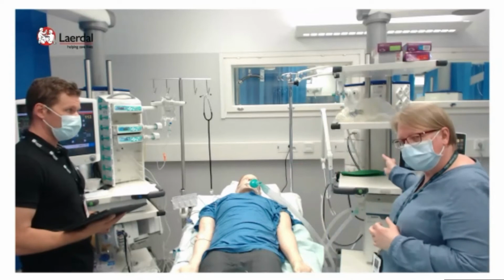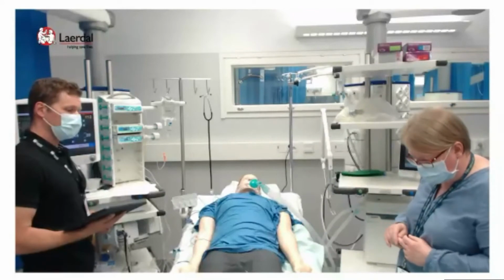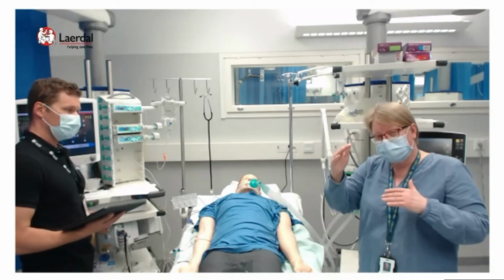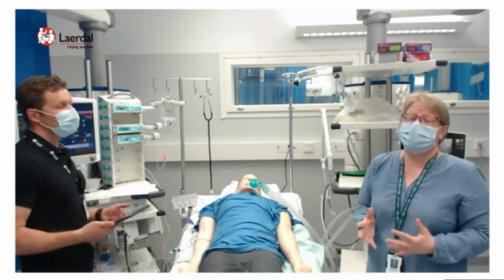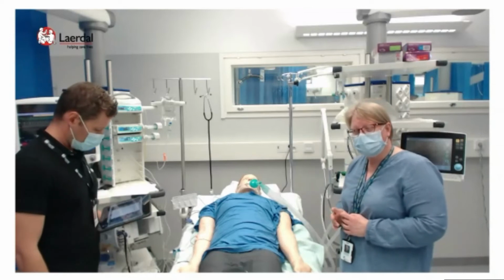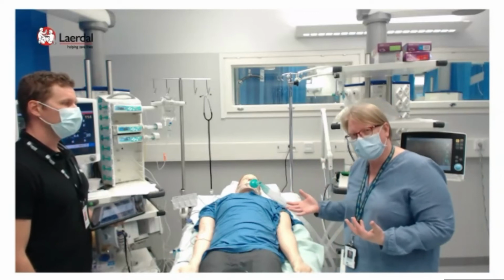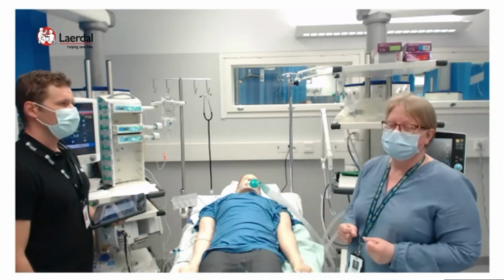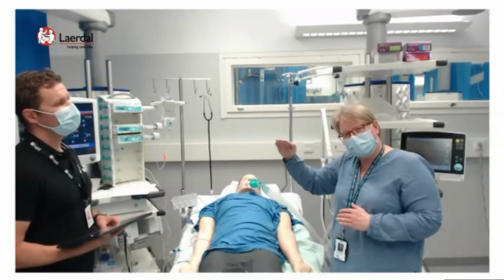Should we try to reduce the tidal volume, and raise the frequency? Lower tidal volume, higher frequency. We still have to eliminate the carbon dioxide from the patient. But it has been established that so-called permissive hypercapnia is not dangerous. The patient can adapt to higher carbon dioxide levels if the rise is steady and slow.